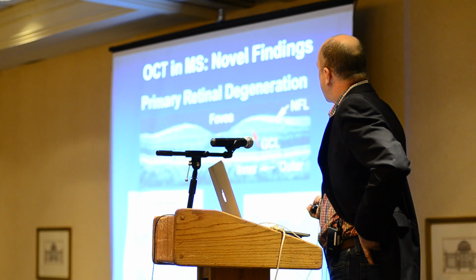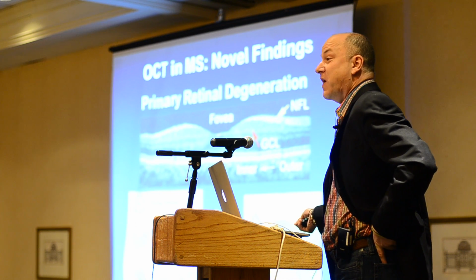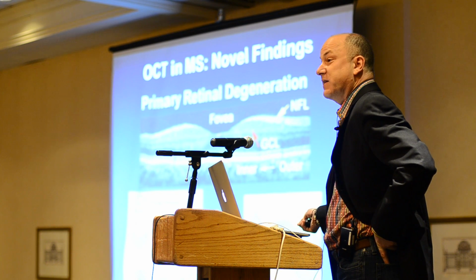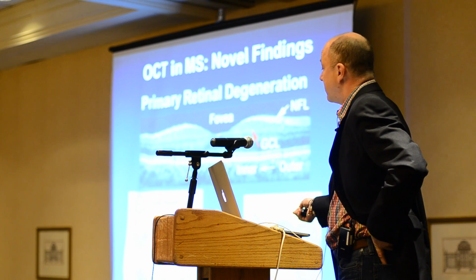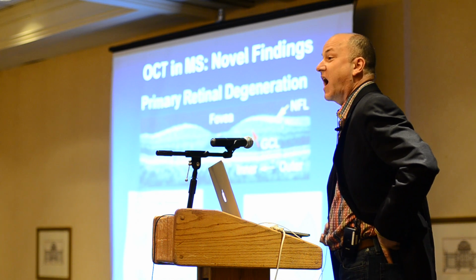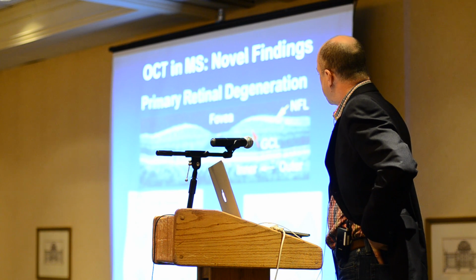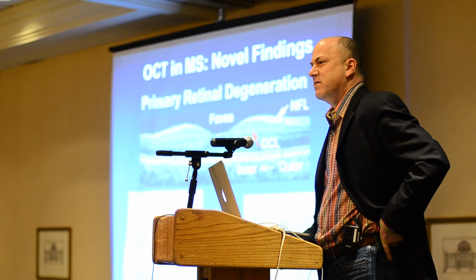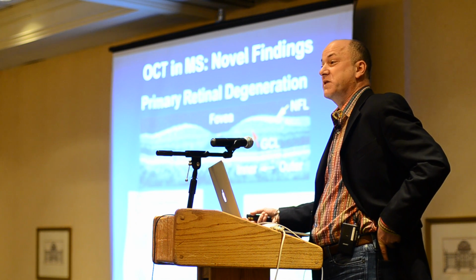The cells here, the ganglion cells, are the ones producing the cables that make up the nerve fiber layer around the optic nerve. So when you have optic neuritis, as shown here in this left eye, naturally you develop thinning in the macula here because those cells right here that are producing these cables are dying because they've been injured. But you notice right here in the smack dab center, there's no thinning because there are no nerve cells there. It's all the light sensing cells or the photoreceptor cells.